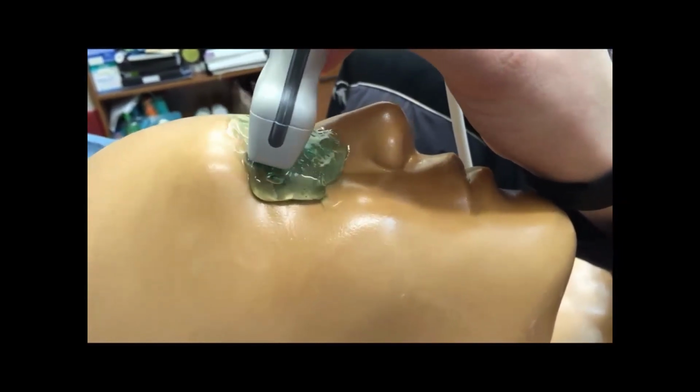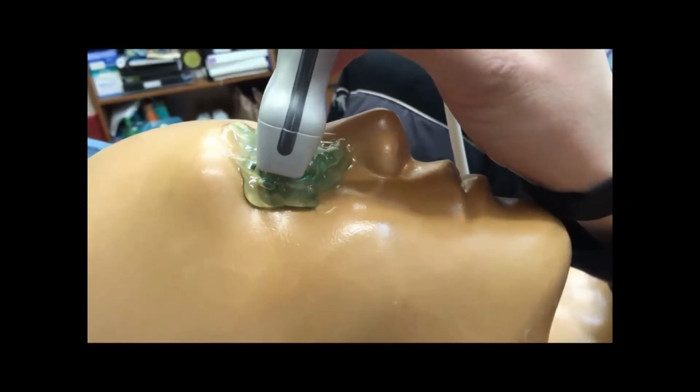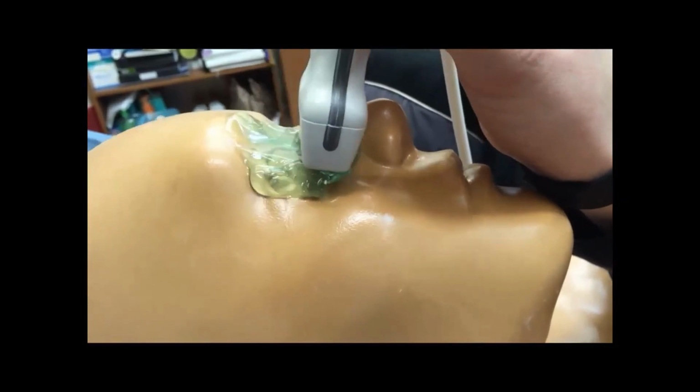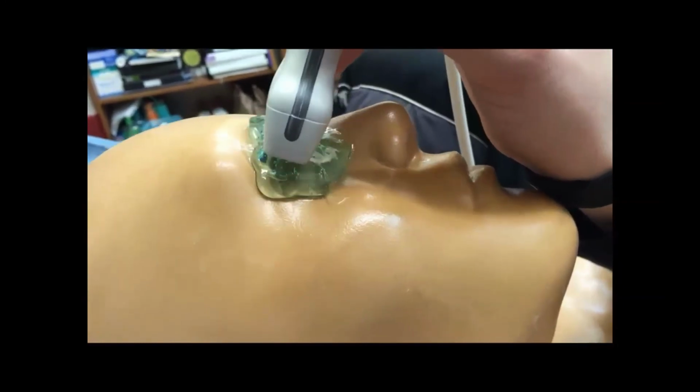And so if you have a partial detachment or a small little detachment out towards the ora serrata or somewhere in the periphery, if you just plop and play and then you're done, you may miss these small little findings that could blossom into something bigger later. So, and then finally, from a technique standpoint, have the patient move their eye around.